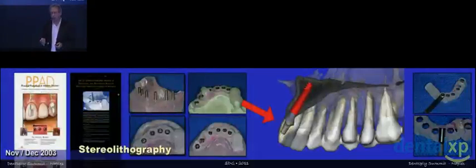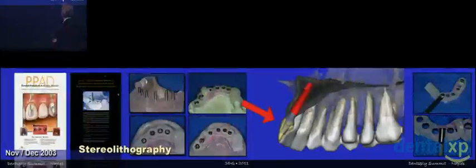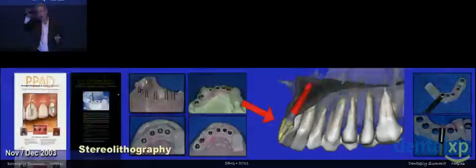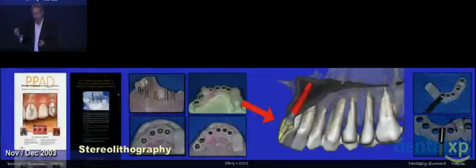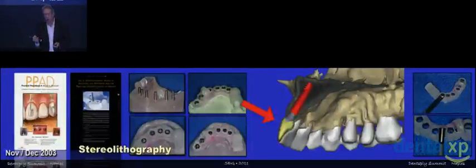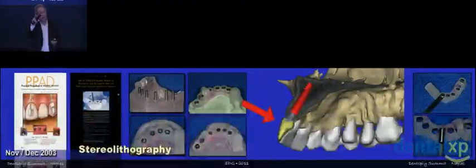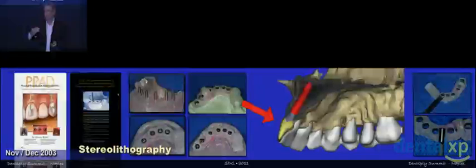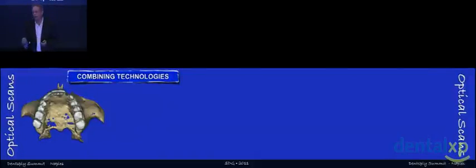And so, as we can see, we also have the rotational position of the implant itself that I call the fifth dimension. That rotational position, flat of the hex towards the facial or whatever the anti-rotational feature is, we need to be able to control it and know where that's going to be so that the scalloped interproximal margin is going to be at the right place when we're utilizing a stock abutment. So having that consistency and repeatability can be done.